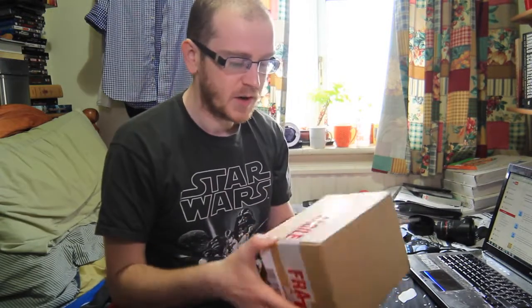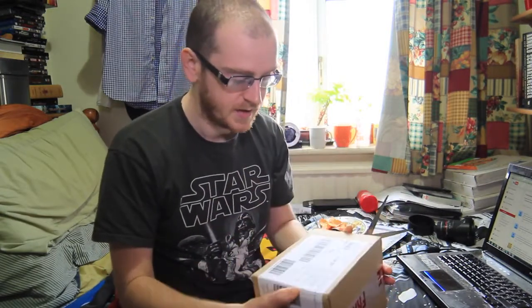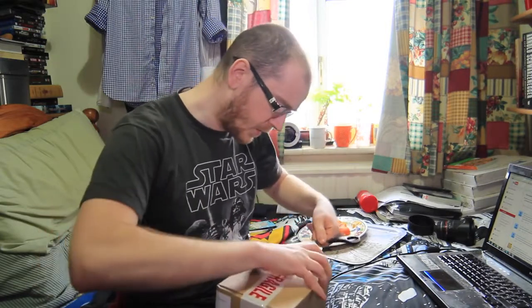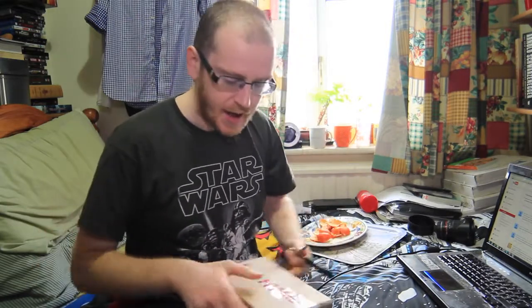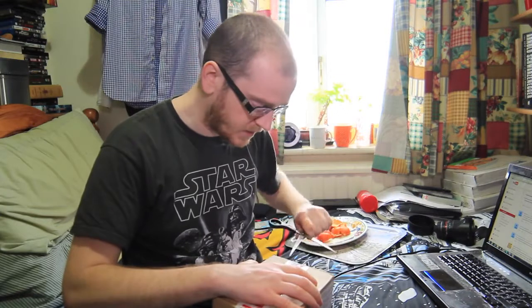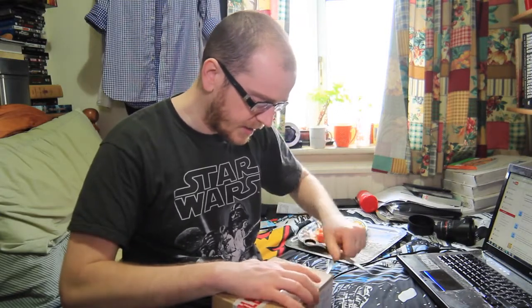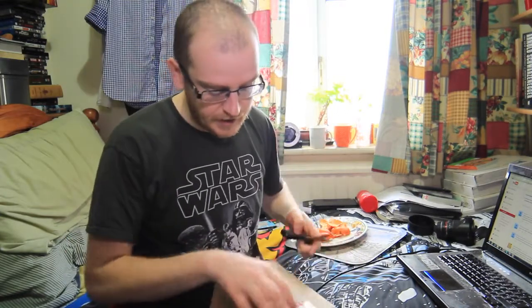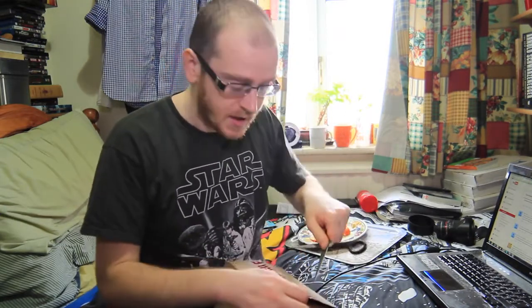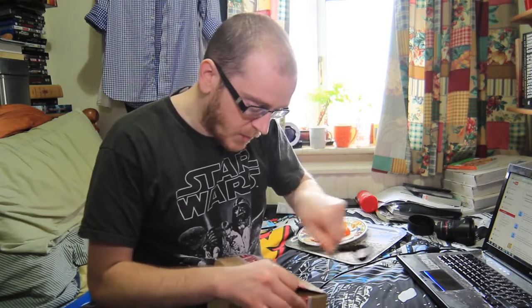Straight away, quite good packaging. Basically, I bought this because I just want to monitor my blood sugars more, but I don't really want to have to prick all the time. The Freestyle Libre allows you to see your blood sugars in real time, all the time, without having to prick.